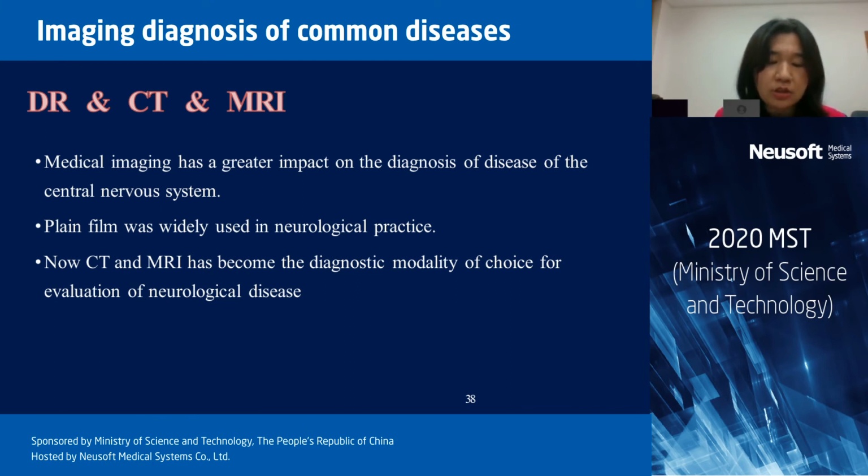Medical imaging has a great impact on the diagnosis of diseases of the central nervous system. Plain film was widely used in neurological practice. Now CT and MRI have become the diagnostic modality of choice for evaluation of neurological disease.